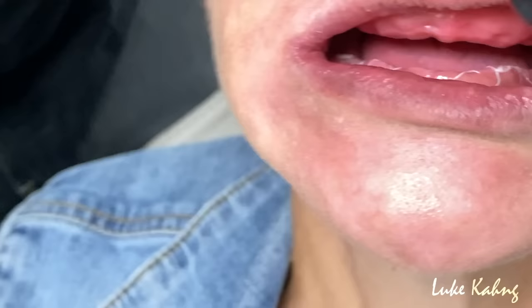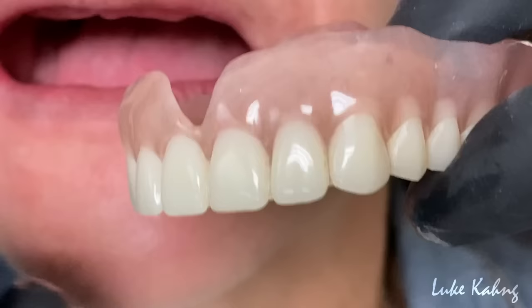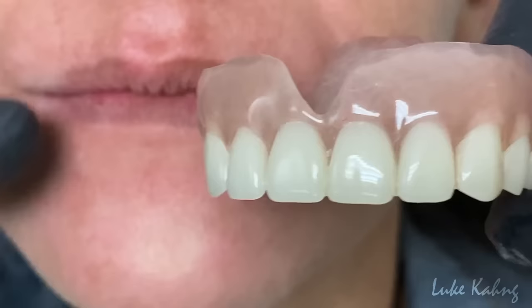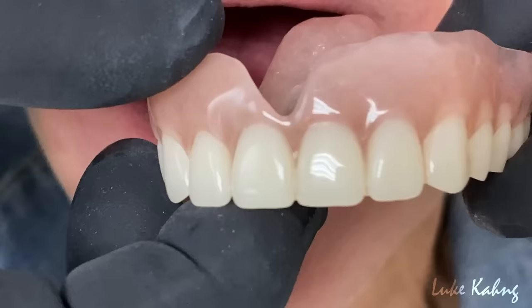All right, this is the current upper denture. The patient came to us because this looks absolutely nothing like her normal natural teeth. And the other problem that she had was the lower denture she couldn't even wear because it wouldn't even close. She had maybe about a 20 millimeter open bite with the lower denture, and she couldn't even close. We have photographs of that. We're gonna give her a nice denture now.